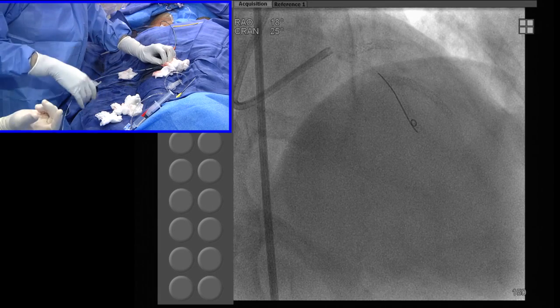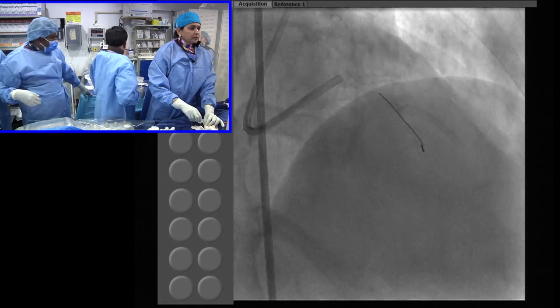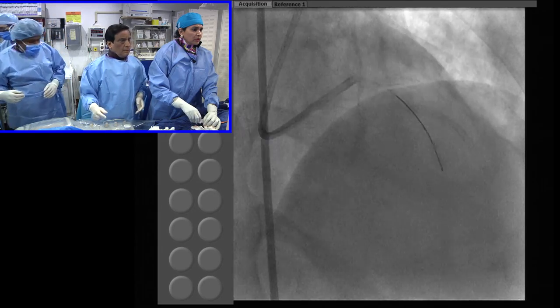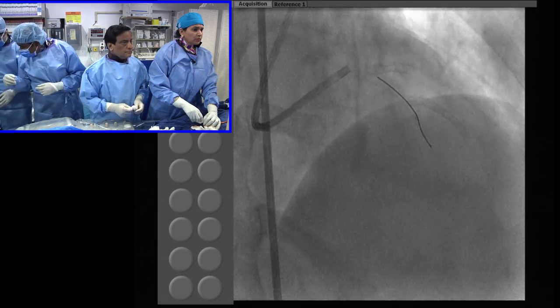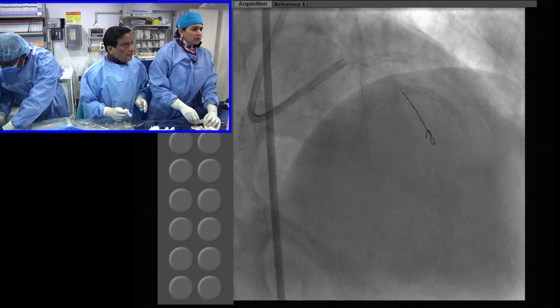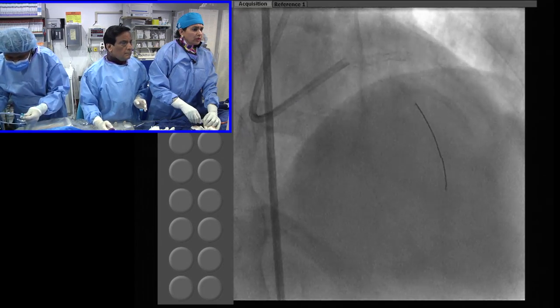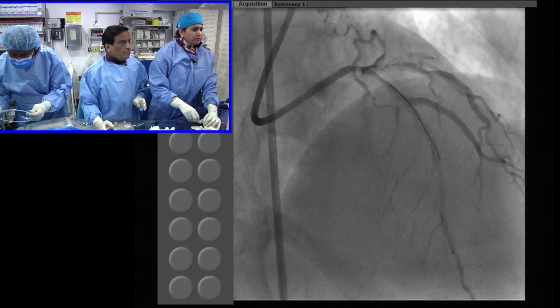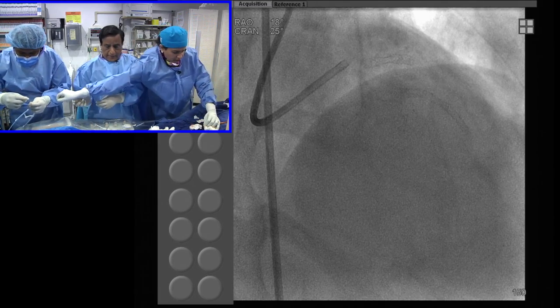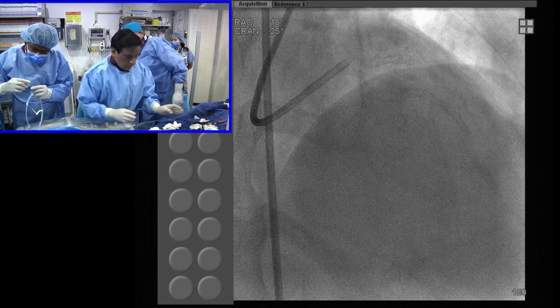Why don't you get a new wire? The wire is sticking out so much. Some dye. Yeah, let's go to the new wire. Just take this out. Don't cut it short, because the wire tip is so badly done. I think wiring through a BVS is not that easy.